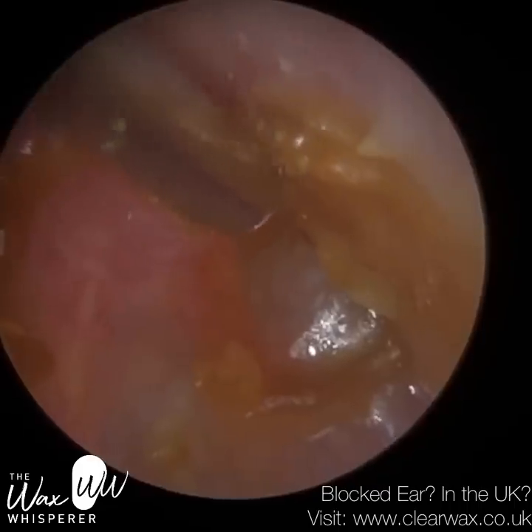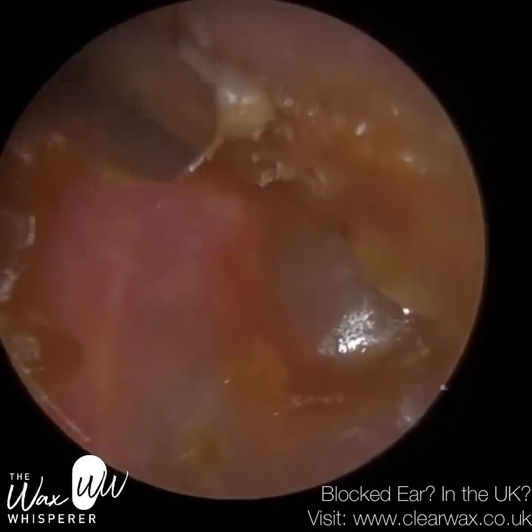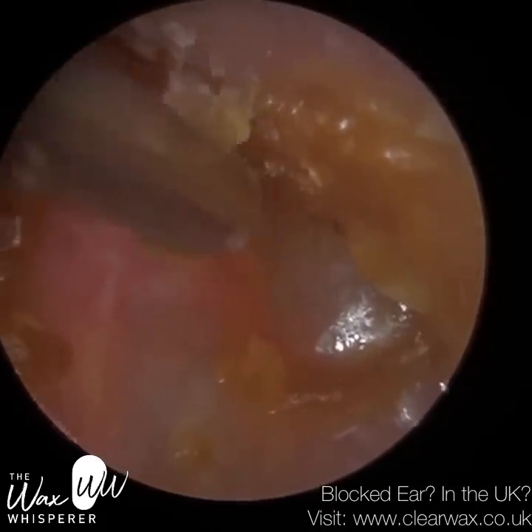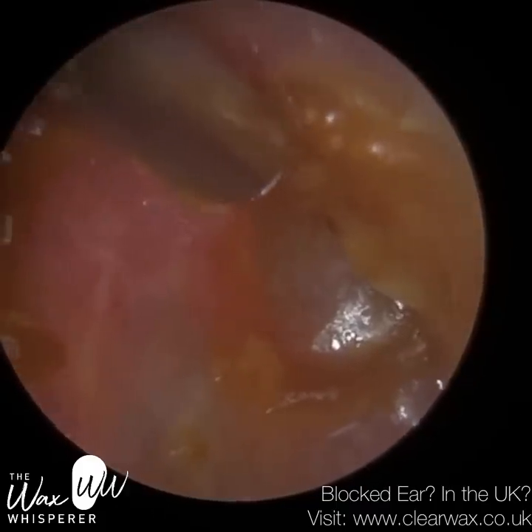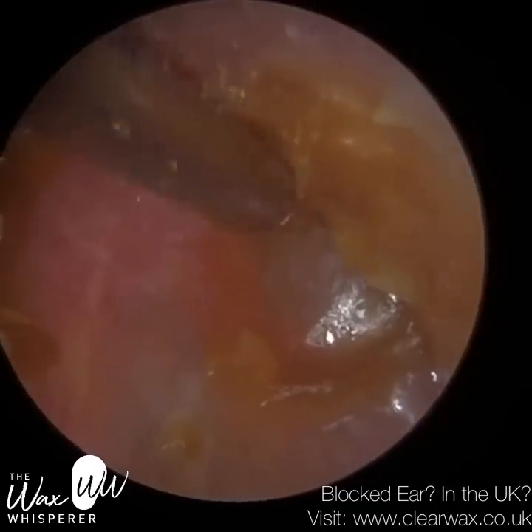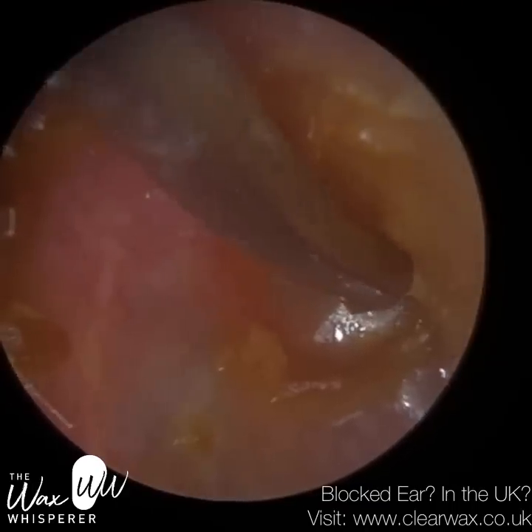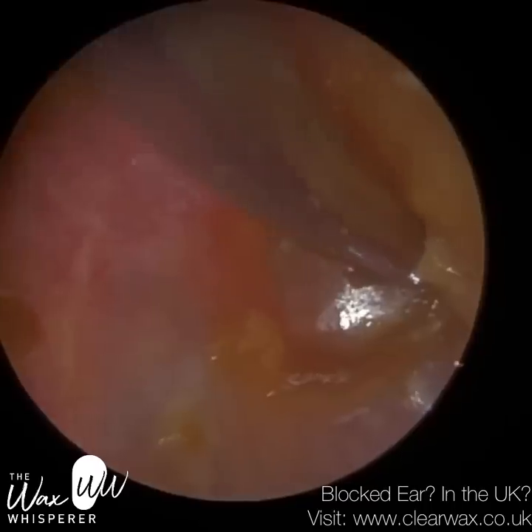There's still some soft sticky wax here. We need to be careful — this is the anterior recess, and the ear canal in this region is extremely sensitive. The skin here is only one layer, whereas the skin on the outer third of the ear canal is made up of three layers.